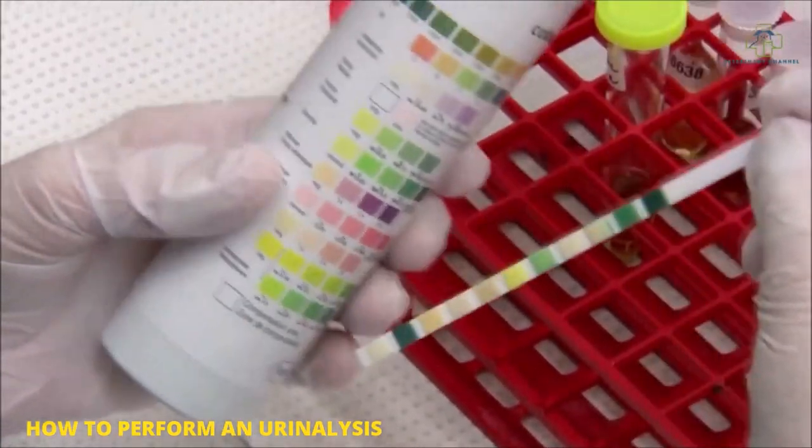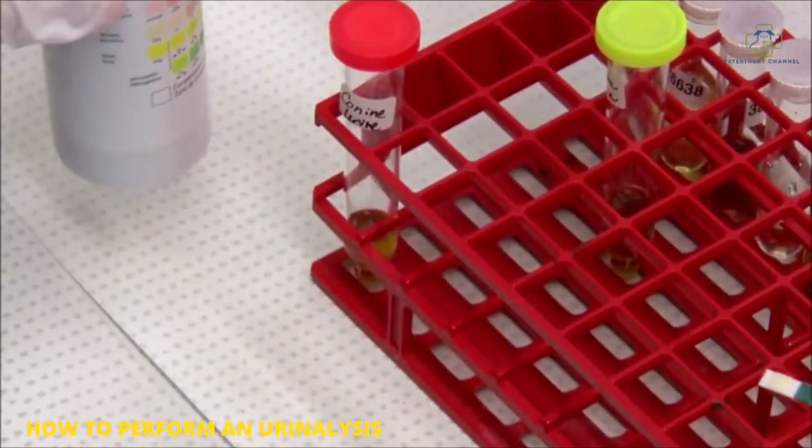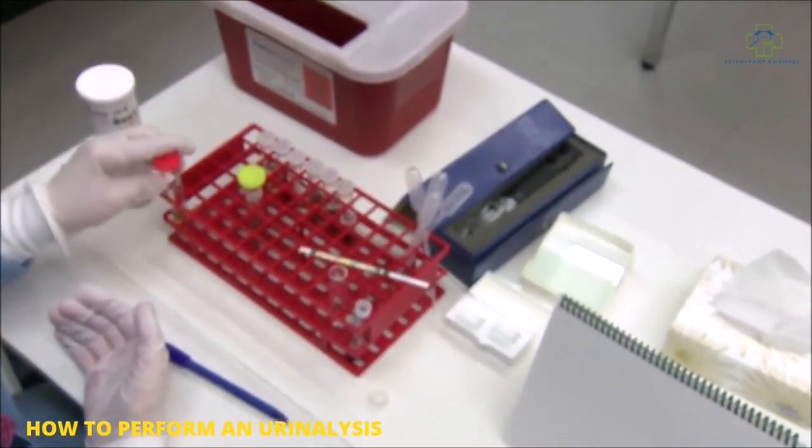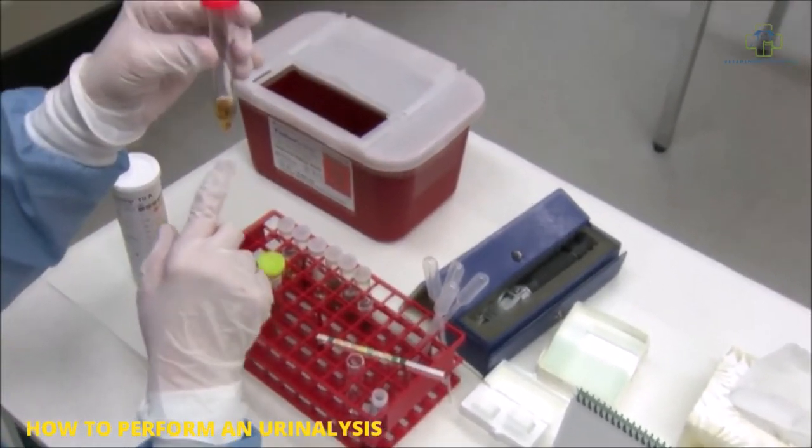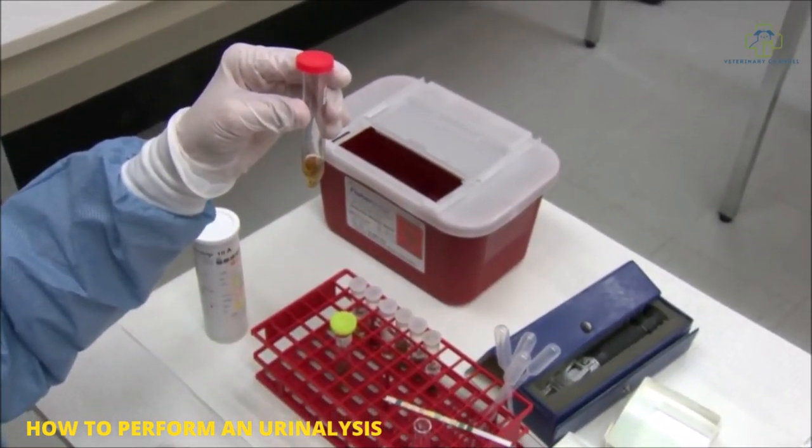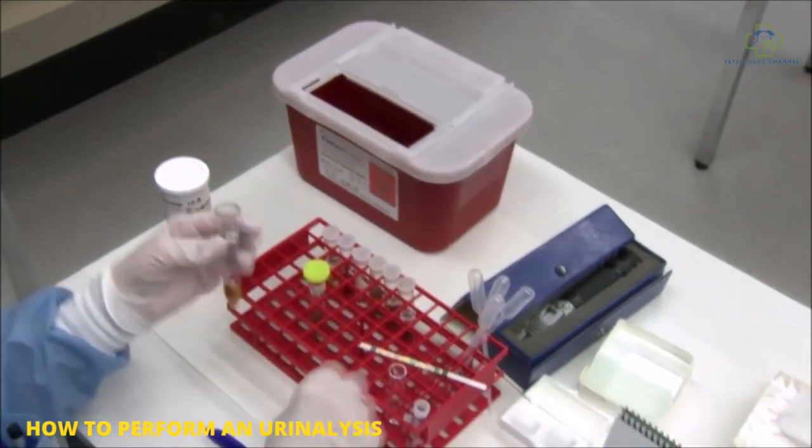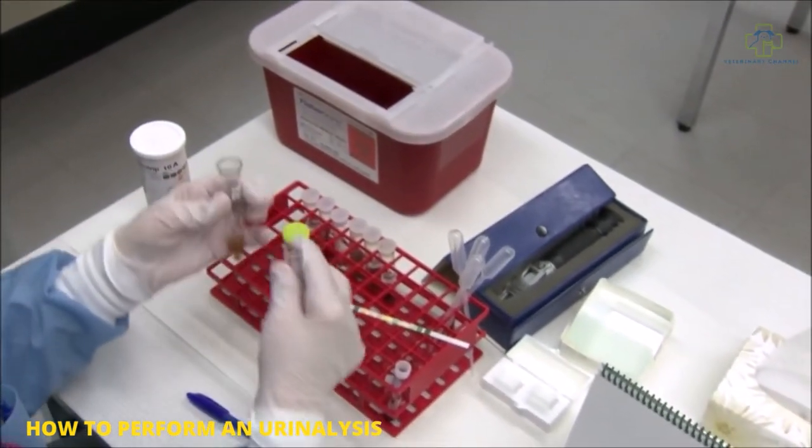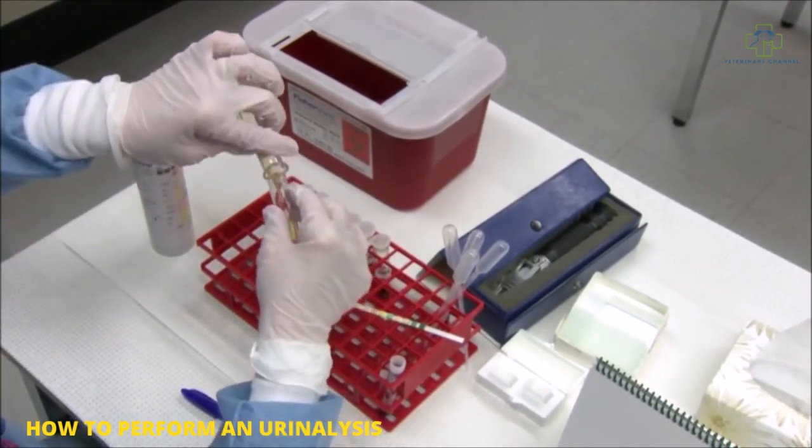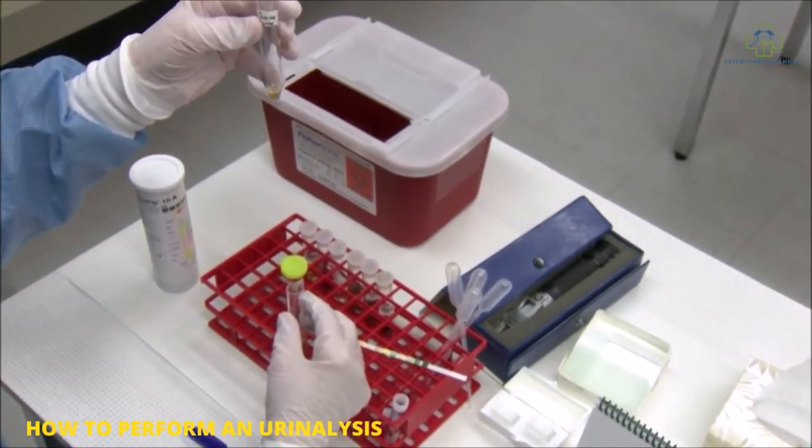After you're done with your strip and your appearances, you want to centrifuge your urine at 1500 rpm for five minutes. You can see there's some sediment at the very bottom of this tube. Once you have your urine centrifuged, you want to pour off the supernatant in just one quick tilt forward and tilt back. The tubes are shaped to leave the correct amount at the bottom for your sediment.